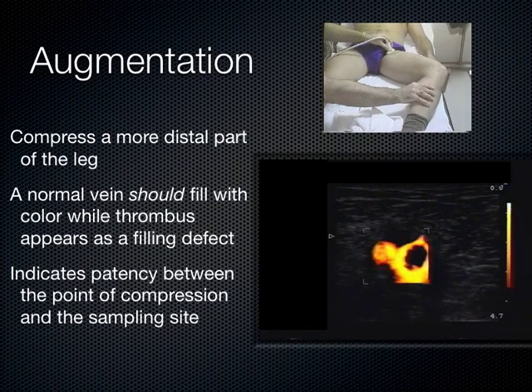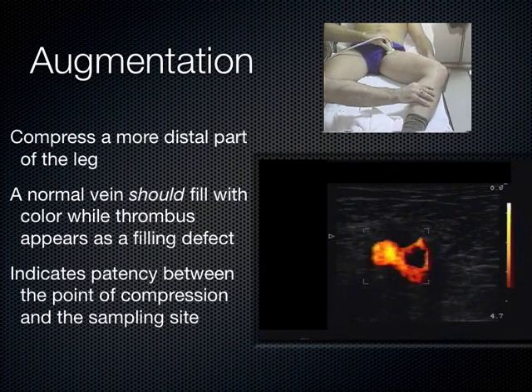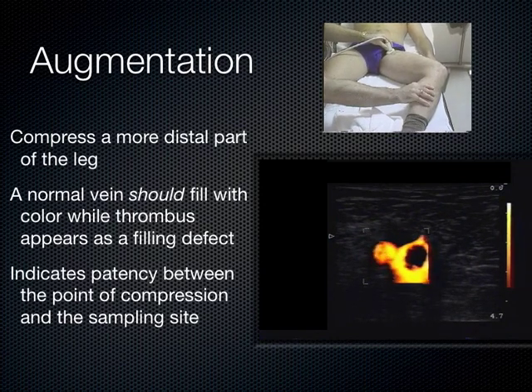It's a fun thing to do. I do it all the time. It's sort of a geeky ultrasound thing I love to do, but I can't rely on it. It's really only the grayscale compression alone, the 2D ultrasound image, no color involved, that rules in or out the DVT. There's lots of other color techniques that don't stand up under clinical conditions, and so you can't really use that. Even though today we'll probably be doing it because it's fun to see the anatomy link up that way. I think that's cool to show you, but diagnostically it's not useful.